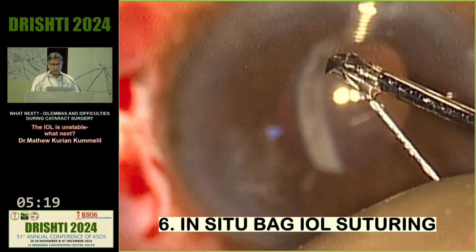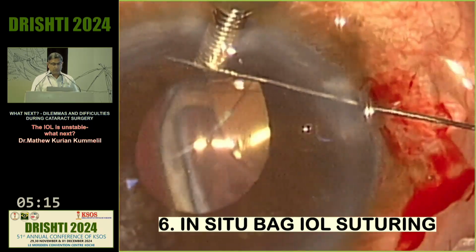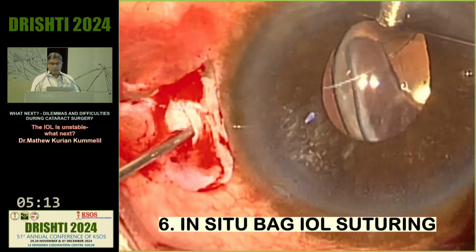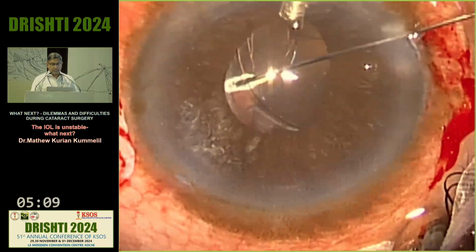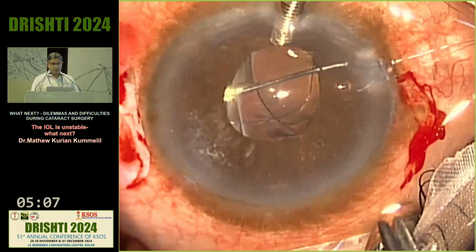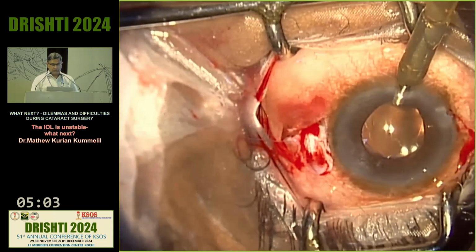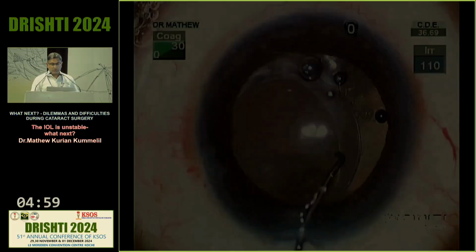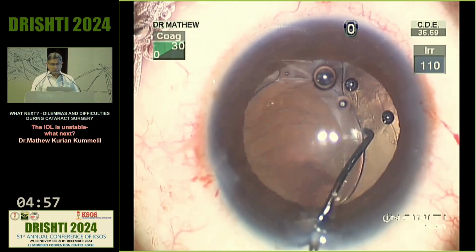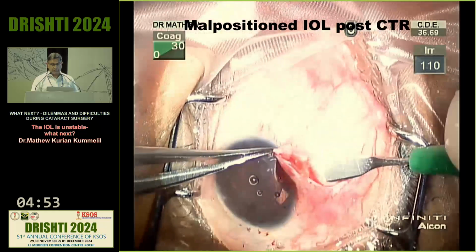And here I am doing an in situ bag IOL suturing through the fibrosed portion of the capsule very near the haptic optic junction, and that will give adequate support to stabilize this lens. The 9-0 Prolene is used and it is sutured and goes into the scleral pocket. This is primarily a CTR that was done for a blunt injury.